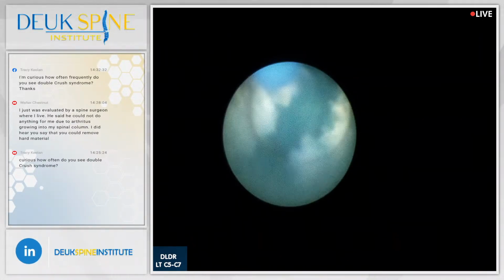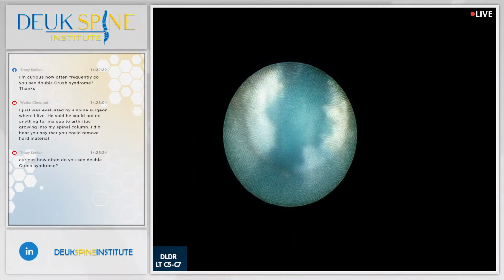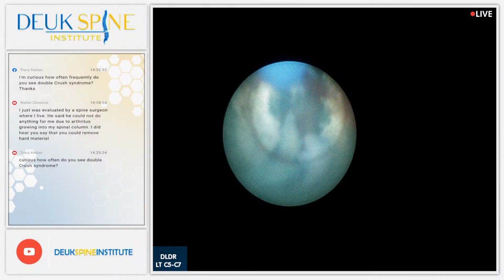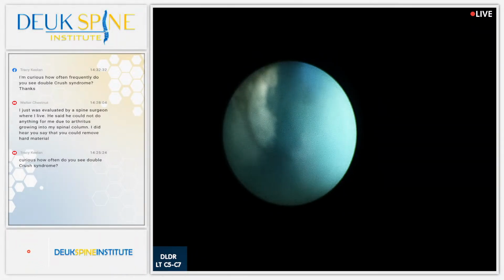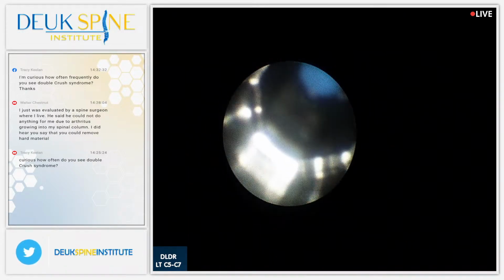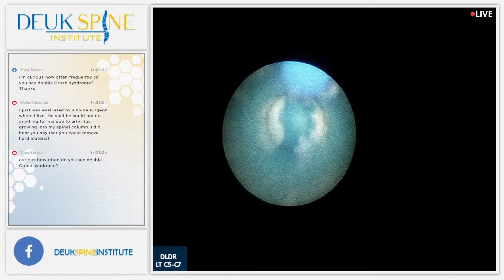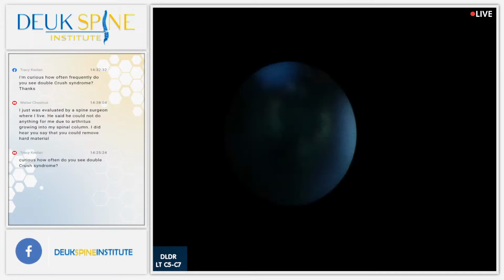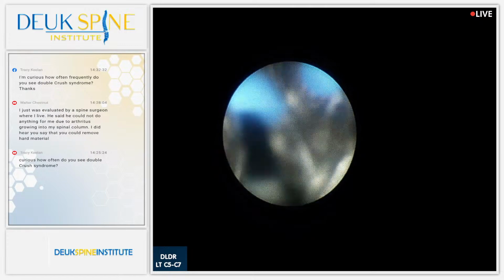All right. What we do have, though, is bone spurs. Look at all that. And look at that herniation wiggling around there. You see it right there? Yes, we do. Boom, here it comes. Just got it out. See how the herniations are really small pieces. They're not big. Remember, this laser fiber's half a millimeter. There's another one. Come on out.